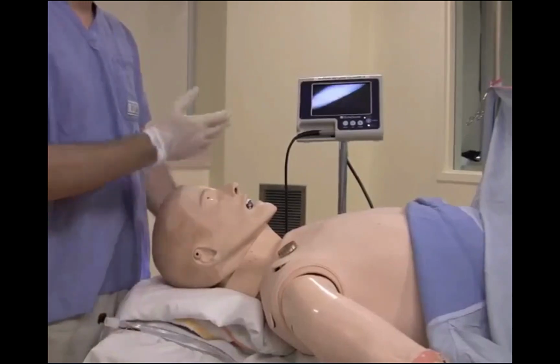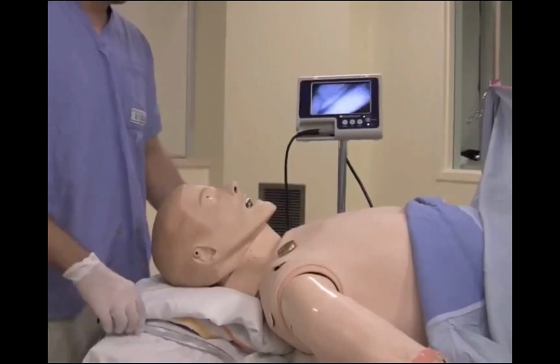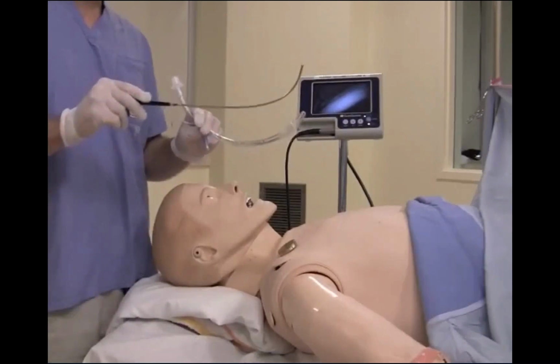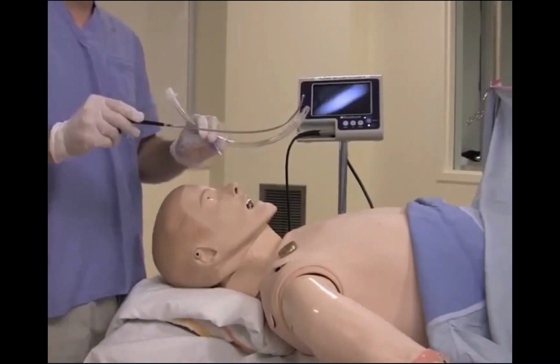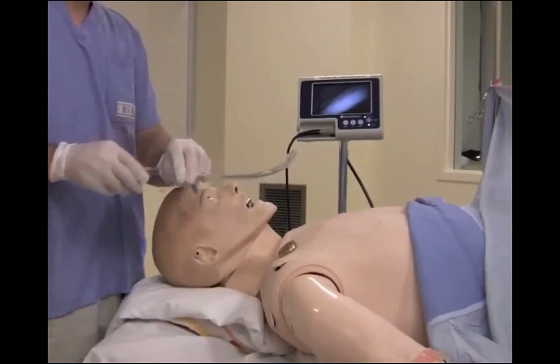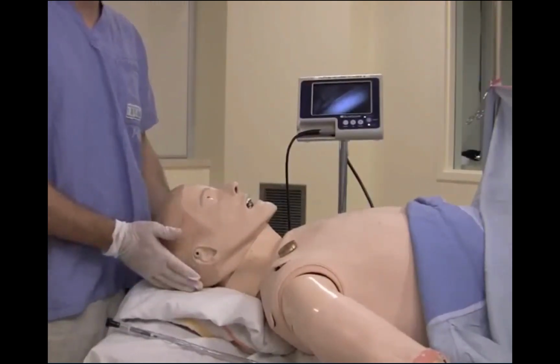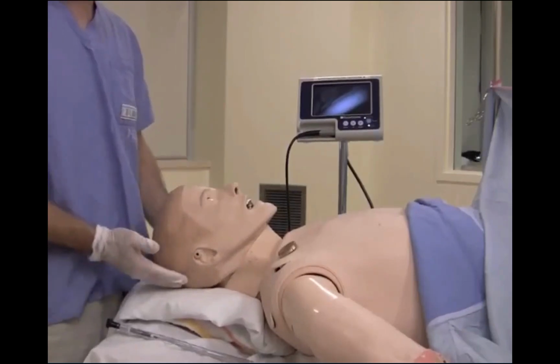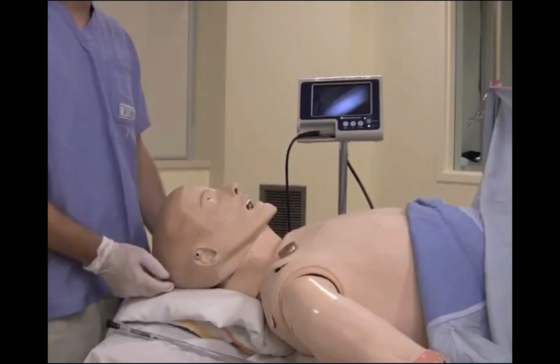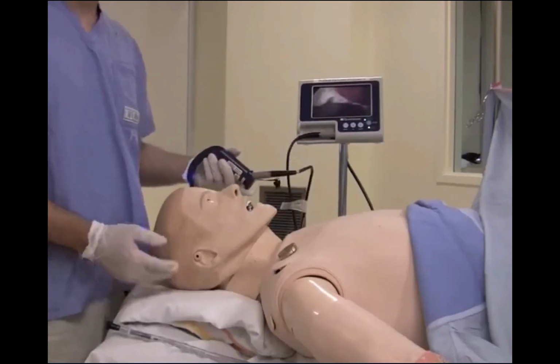For this, we will need a Glidescope with an appropriately sized Glidescope handle. We'll also need a standard endotracheal tube and a specifically designed stylet for the Glidescope. Here you want to insert the stylet before you start and have it ready beside the patient. We also need an appropriately positioned patient. Here you can see that the patient is in a sniffing position with flexion at the lower C-spine and extension at the upper C-spine.